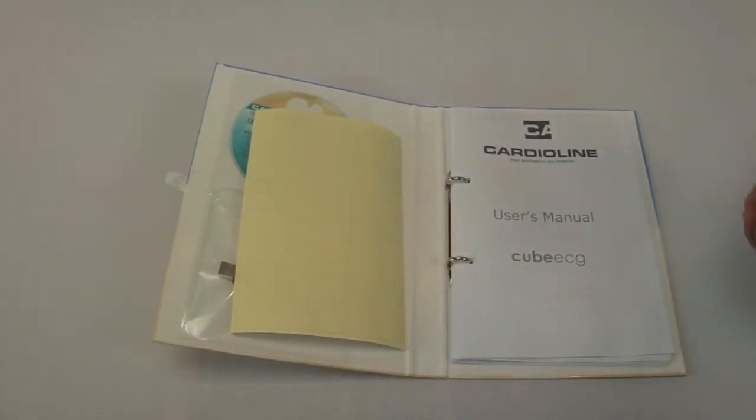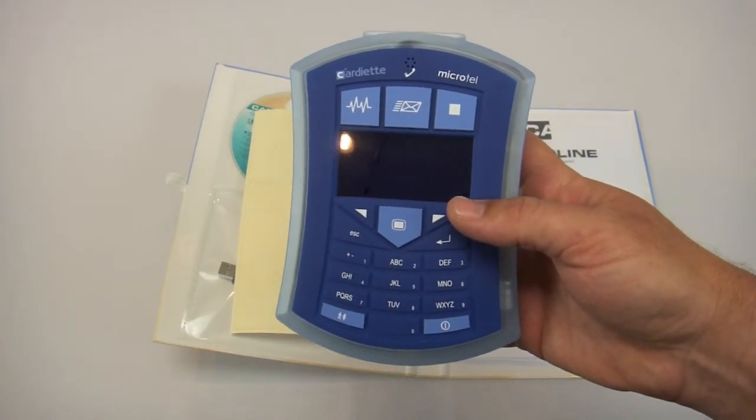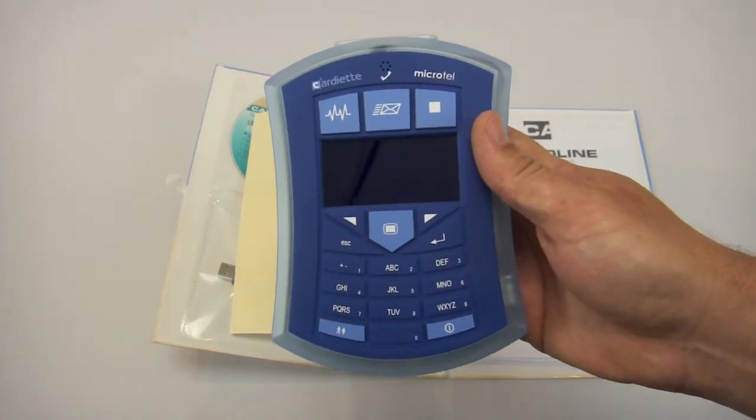The Microtel is the first in its class that we're aware of to offer real-time Bluetooth connectivity to the computer in a nice, compact, handheld form factor. Thanks for visiting CardioLine U.S.